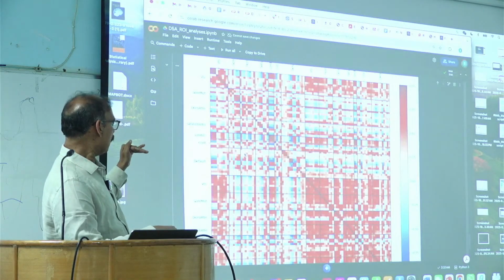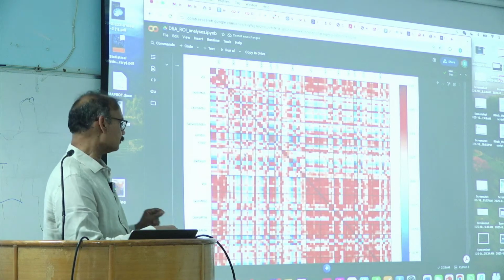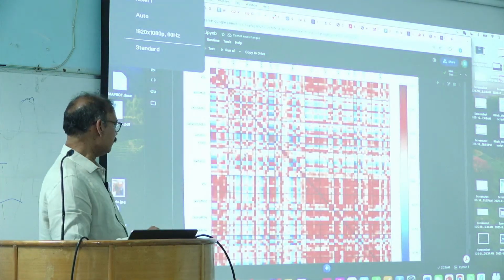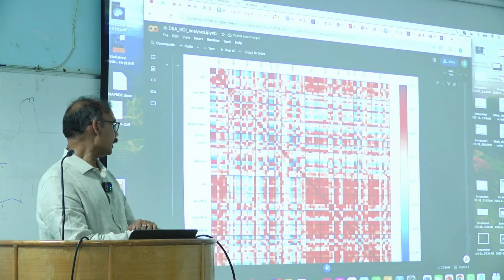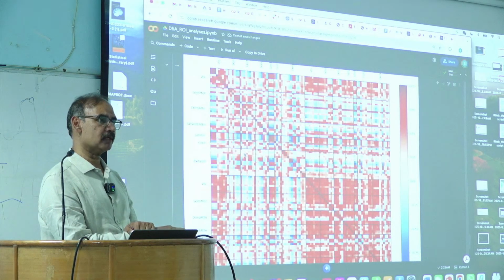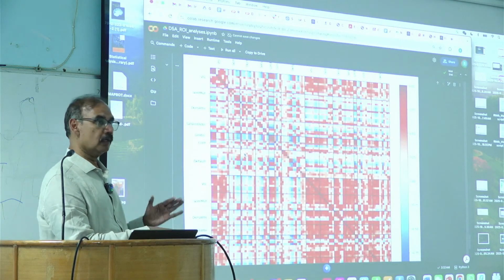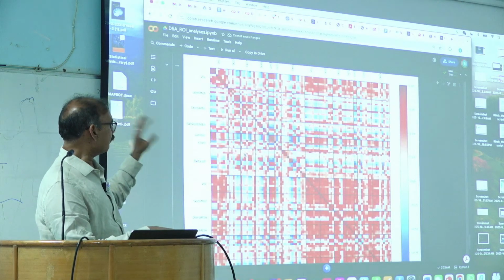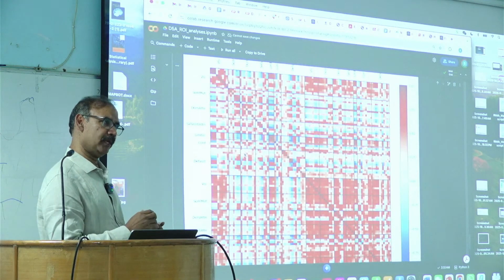However, we can look at any specific region that we want. That is one way to think. The other way is that once we have all these measures, this is a different way to look at brain connectivity. For example, you can see how different regions are connected, and then you can make aggregate properties.